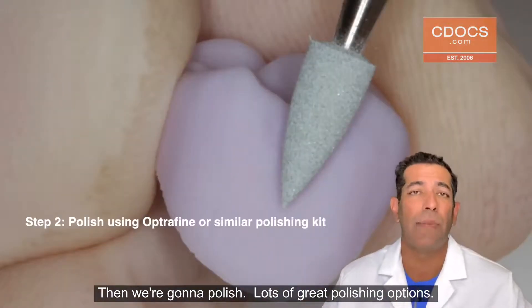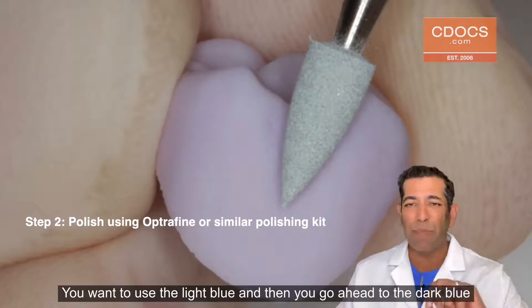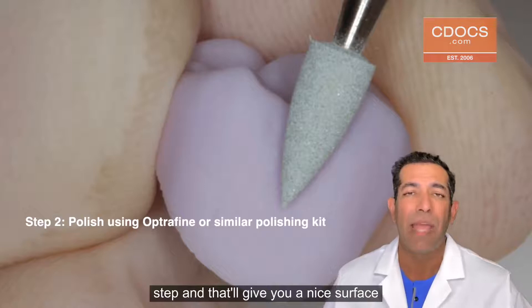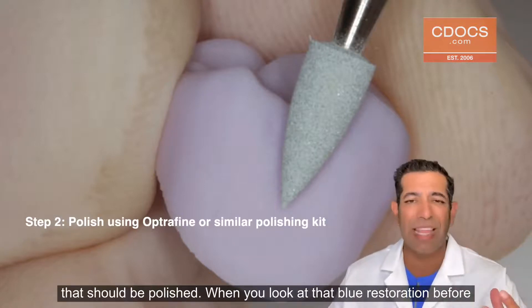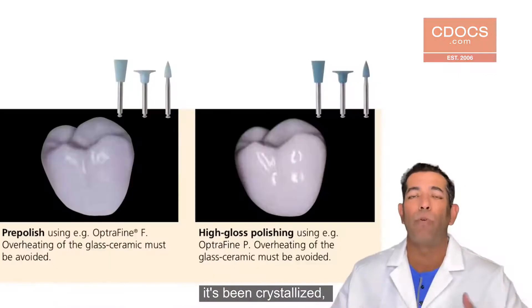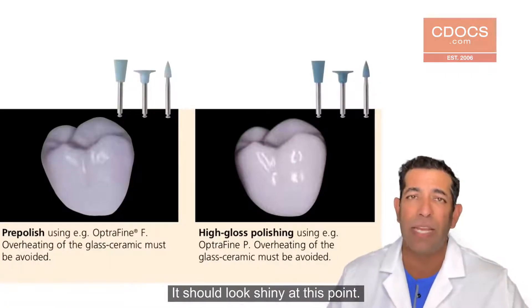There are lots of great polishing options. One of them is Optrafine from Ivoclar. You want to use the light blue and then go ahead to the dark blue step, and that'll give you a nice polished surface. When you look at that blue restoration before it's been crystallized, it should appear polished — it should look shiny at this point.